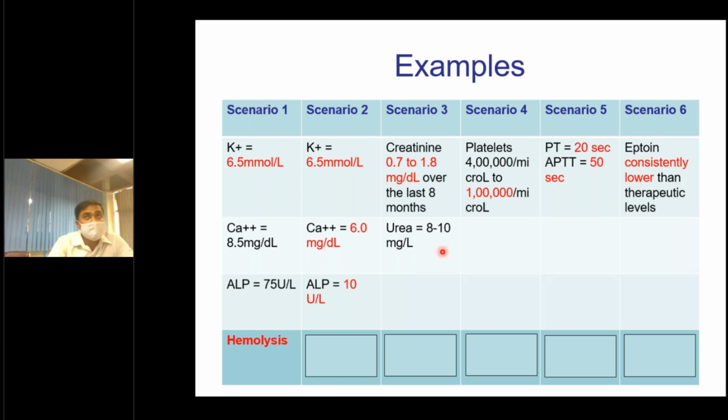Hemolysis can happen because the sample was not set for 10 to 15 minutes before being shipped, or if the sample is forcefully injected into the tube, or if it is immediately brought in contact with ice cold material. Hemolysis can not only lead to a rise in potassium values, but also to a rise in other parameters, such as LDH.